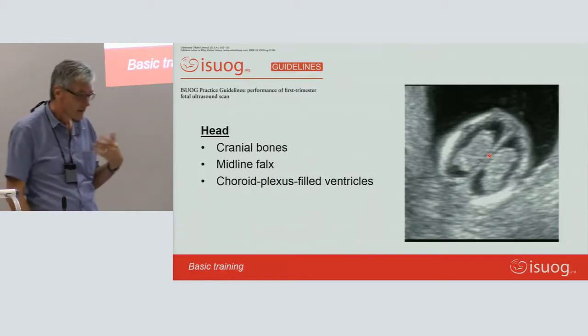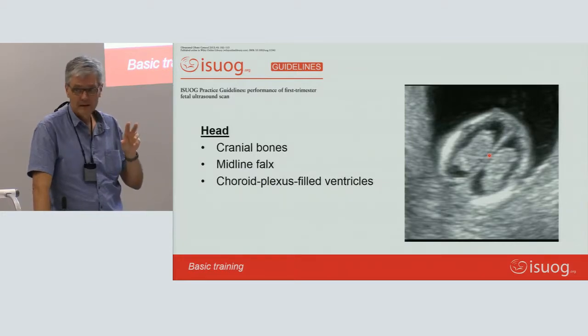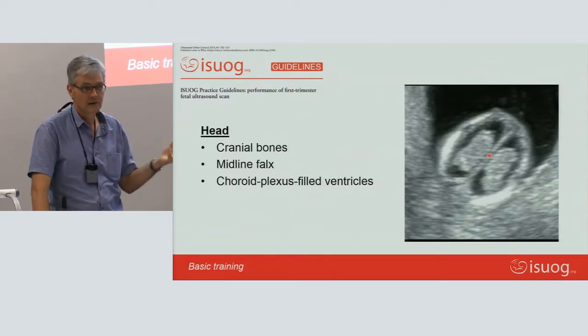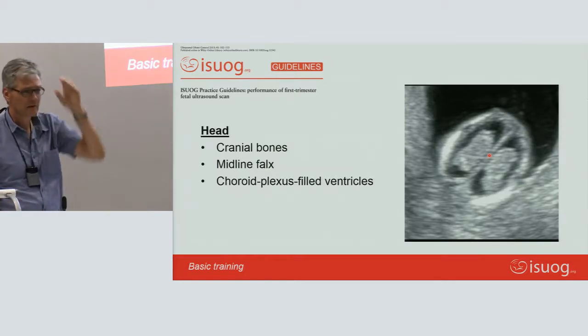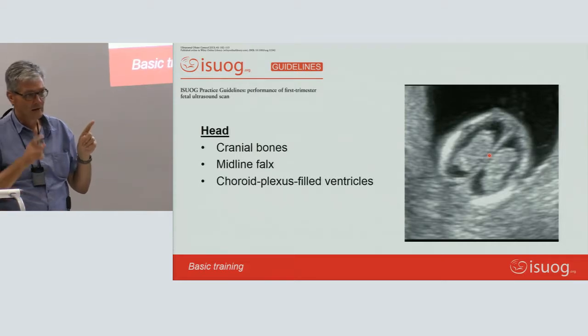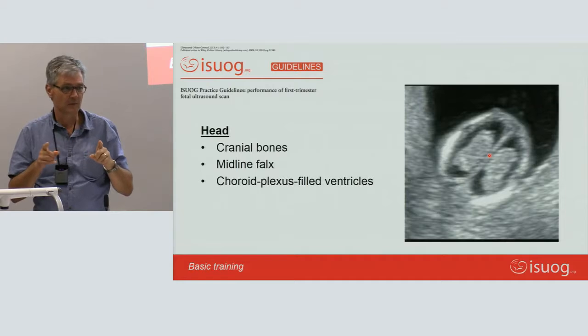And usually, where studies have been done to look at ultrasounds with undiagnosed abnormalities, and I think the biggest one I know was in cardiac abnormalities that were found, the time of the ultrasound examination is compared.